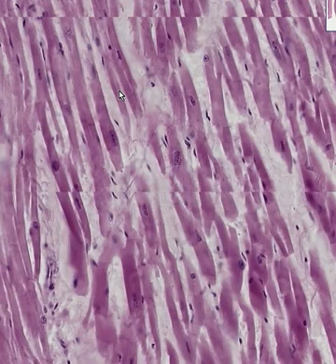But two things separate this from skeletal voluntary striated muscle. Whereas I think I could convince you that maybe there are some striations, the nuclei are clearly within the center of the fiber, like here, like here, like practically everywhere. And in addition, the fibers are not stacked up nicely like logs on a fireplace.